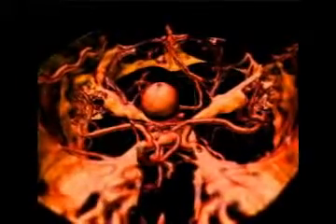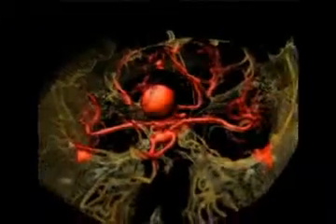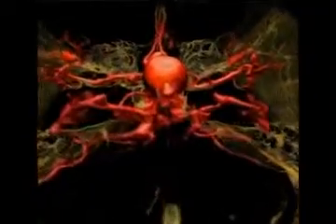And so we worked with someone in our department who we recruited, Ramin Shahidi, and he actually took a leave of absence to start a navigation company, and you can see very nice imaging, and you can dissolve away the bone. This is actually a patient with two aneurysms, an ACOM aneurysm and a basilar aneurysm.